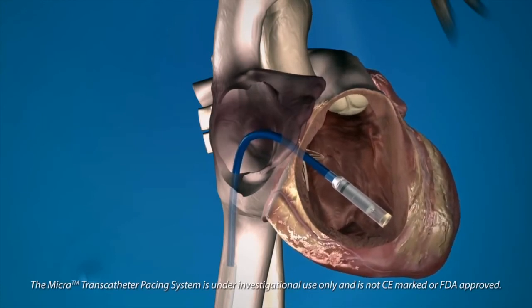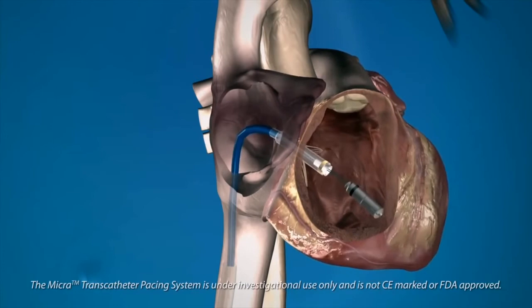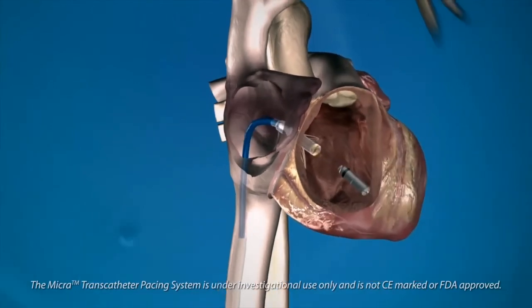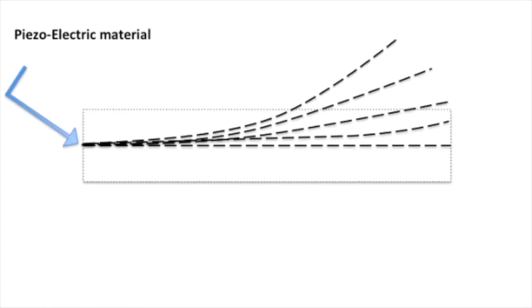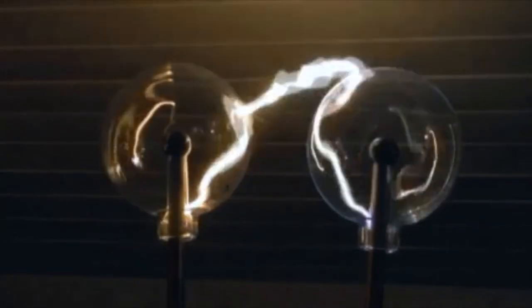However, when it comes to technology, there is always room for improvement, and one such improvement could be the use of piezoelectric materials to make the system completely self-sufficient and remove the need for surgery due to device replacement or battery replacement. Piezoelectric materials are materials that generate a charge when they are deformed.